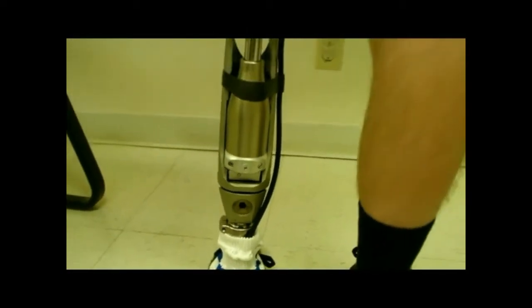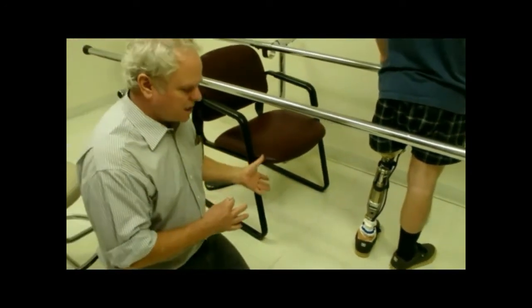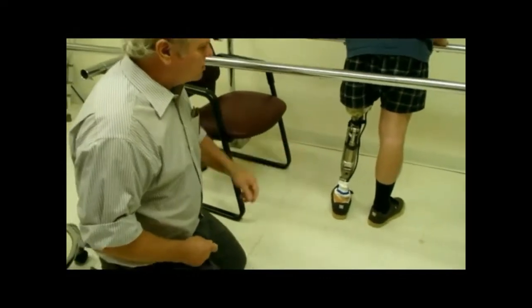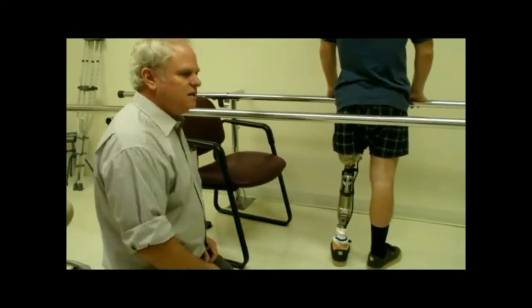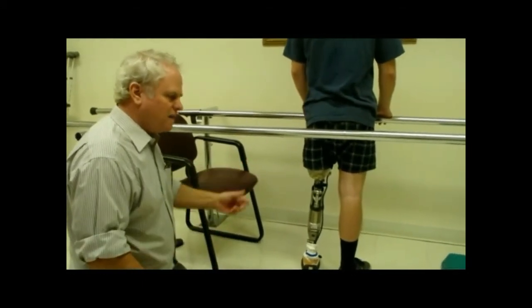The importance of the yield is not only that it helps them sit, that's the first setting. How do we sit? How do we control this? But it's also the function of going down a hill, going downstairs, going down any kind of ramps, any of that nature, they're going to ride the knee.